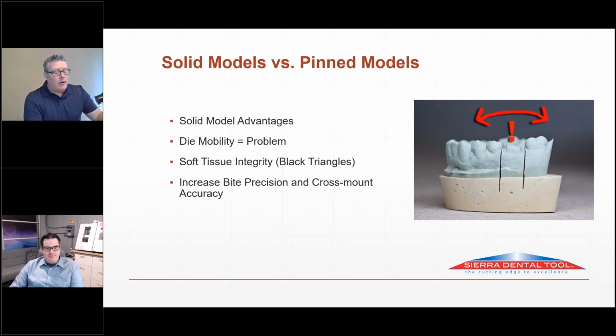It's a day later, all of a sudden they have it open, the whole occlusion's open. And you're thinking something's wrong with the milling machine, the tool's bad. And you don't really think that the whole thing happened because the guy scanning it in raised the die up. I mean, it happens all the time, pretty much probably once or twice a month on a regular basis.